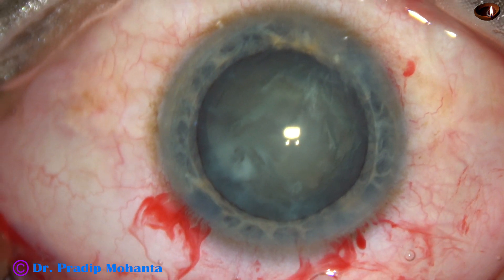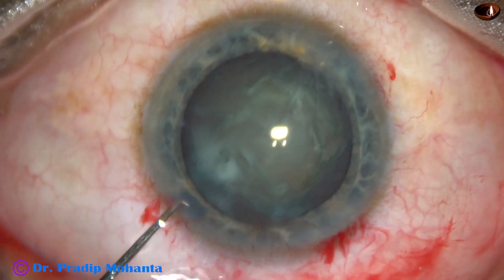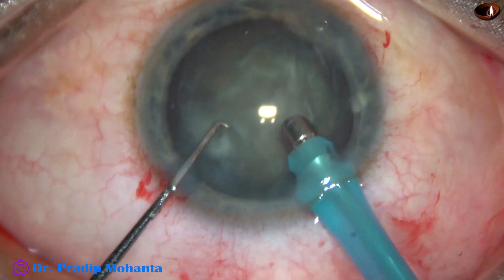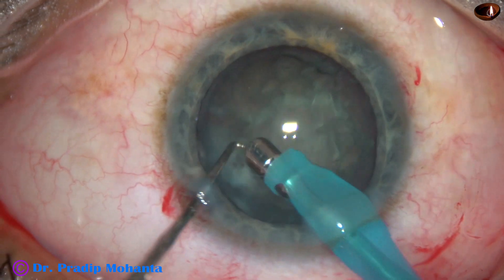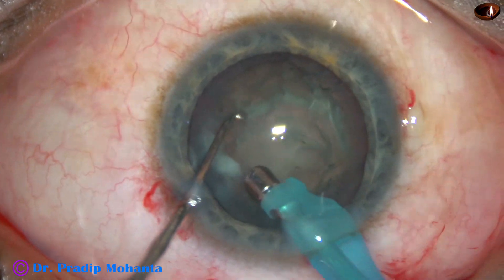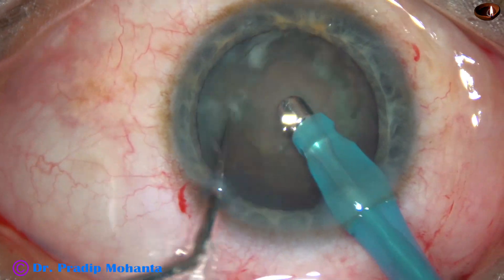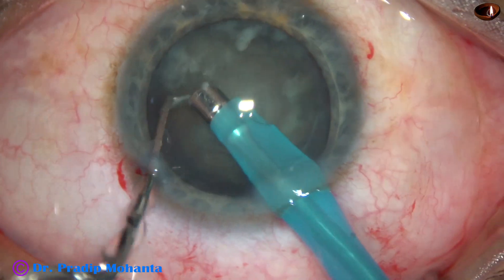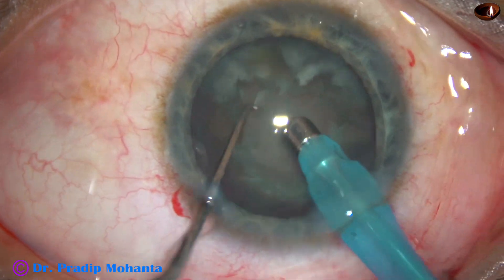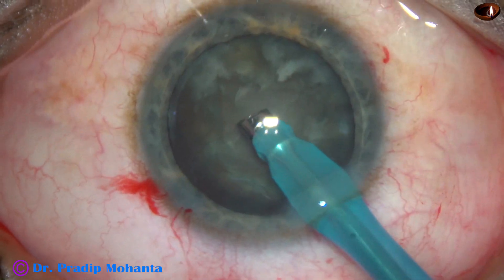There should not be fluid buildup behind the lens. Viscoelastic is injected. And now, the tip of the phaco needle goes in with its bevel down. Some superficial cortical lens matter is aspirated. You can see this is a soft cataract. The nucleus is rotated clockwise and anticlockwise a few times. This will facilitate aspiration of cortex in the later part of the surgery.